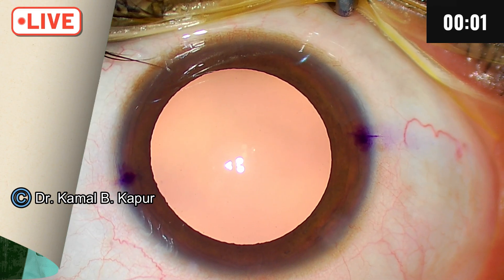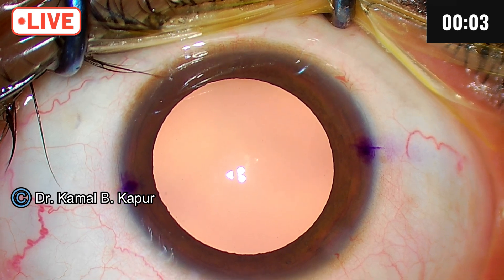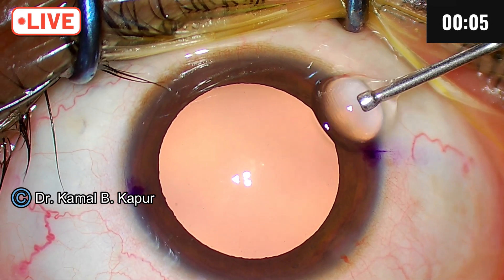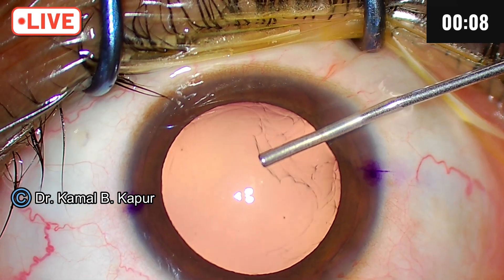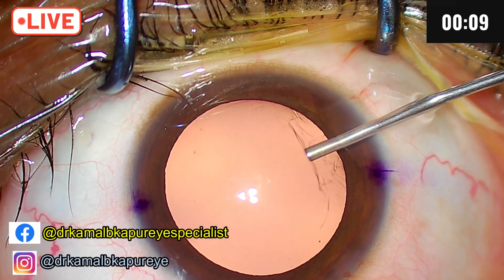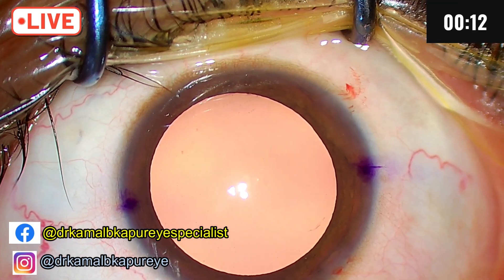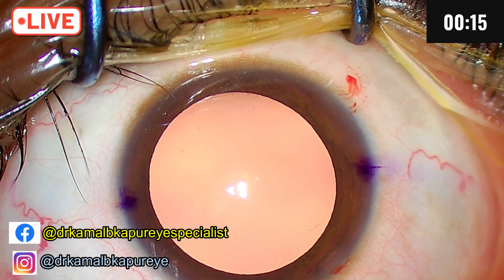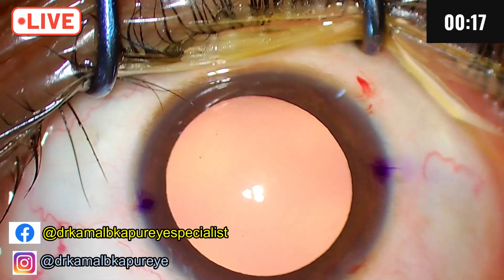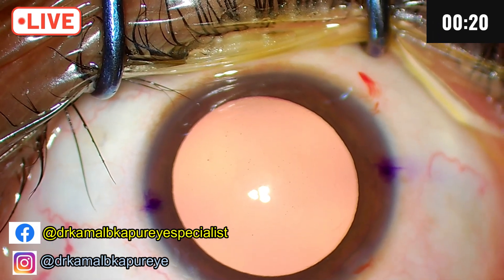Post-C3R, nearly 8 to 12 months post cross-linking, we are doing a fakic IOL implant. The patient has a fakic IOL with minus 7 diopters of astigmatism.